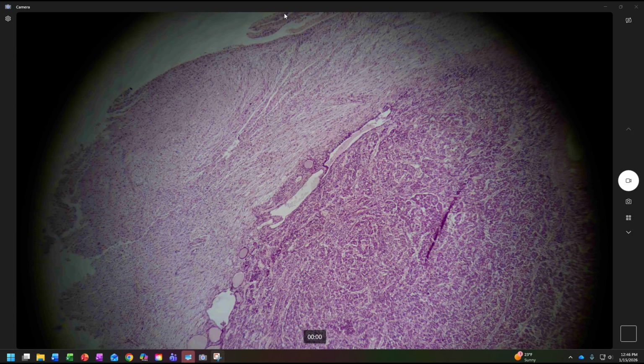However, this is still pituitary gland. How do we know that? Because we've got this large area here that's kind of darker and grainy, and we have this area here, again, not as large, and I can't show the entire pituitary gland on the slide. I think this one is from a human, so I don't even think this is the entire cross-section.